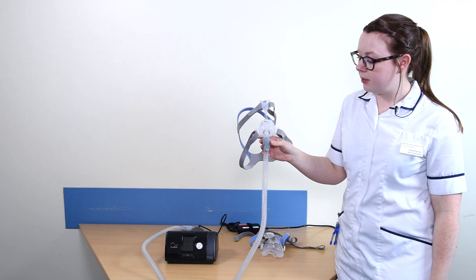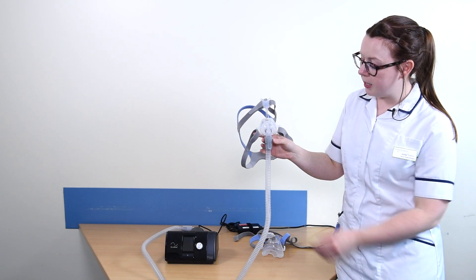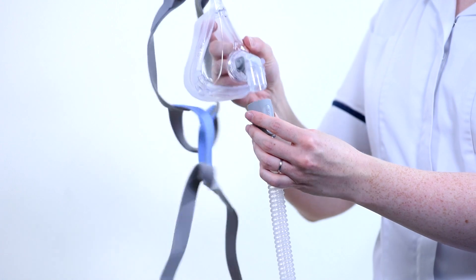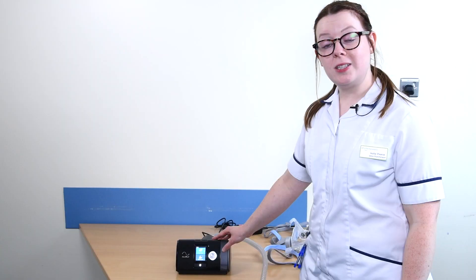When you are first getting used to your mask, you may try different mask types. To swap your mask, remove it from the gray tubing and attach the new mask. All of our masks will fit on the same tubing.